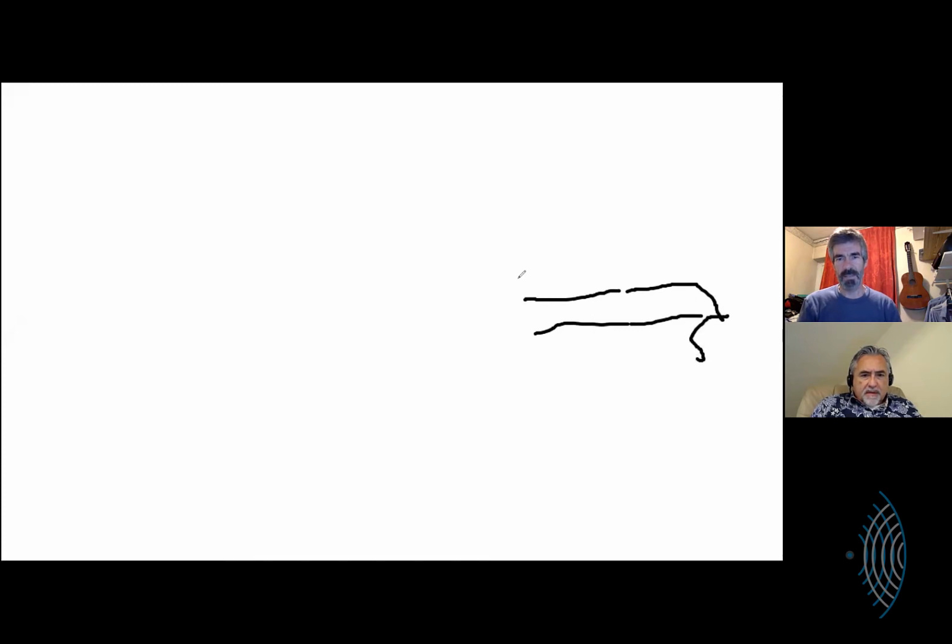It comes up here and gets thinner and thinner and broader, but it's still one structure. This is in long section. You get beyond a certain point and it actually becomes divided. So you've got 2 layers of fascia.